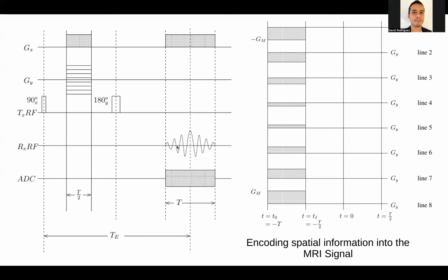Yeah. And then your other question was about sampling. I've never seen it, but you could do everything in an analog fashion. But these days, everybody digitizes the signal, and you need to get enough samples of your signal in order to get proper image reconstruction. In the next few slides, we're going to talk about aliasing and field of view, and the sampling frequency that you use will affect those two parameters. Yeah, okay, my question was going in that direction.